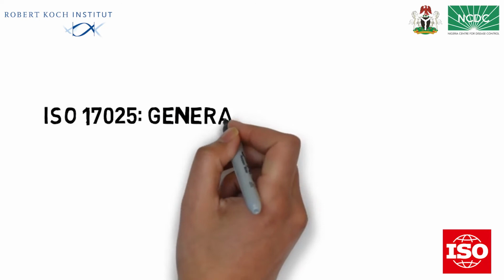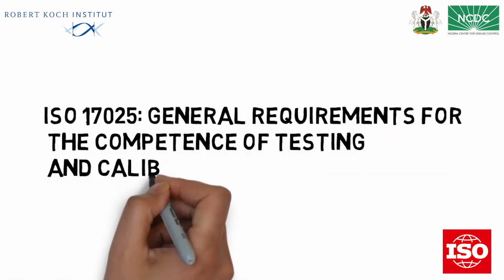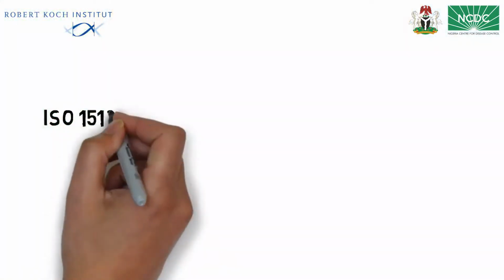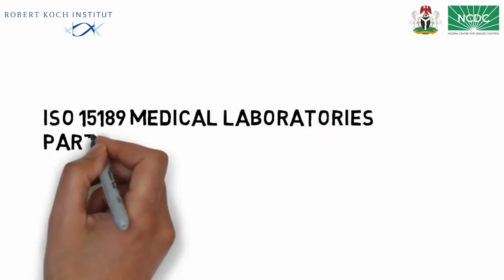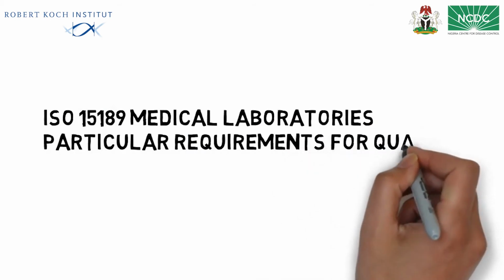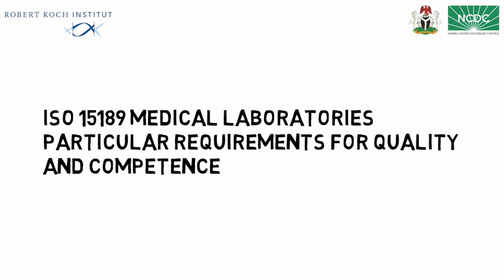International Organization for Standardization, that is ISO. ISO 17025 is a general requirement for the competence of testing and calibration laboratories, whereas ISO 15189 is for medical laboratories, that is people who are performing the testing in a medical lab, with particular requirements for quality and competence.